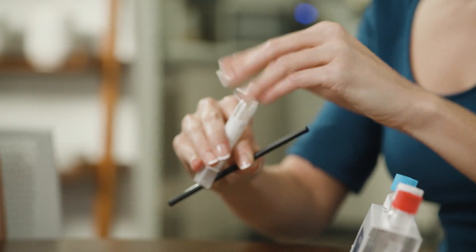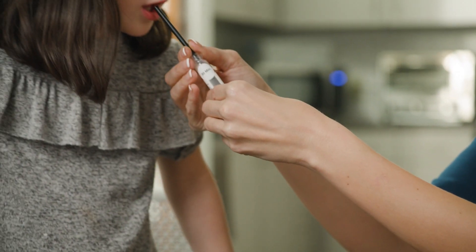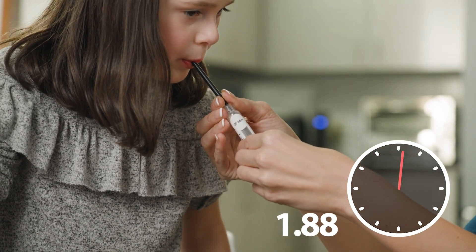Now that 30 minutes has passed, you are ready for the second tube. Remove the test tube labeled 30 min from the box. Breathe into the second test tube for 5 seconds, same as before.